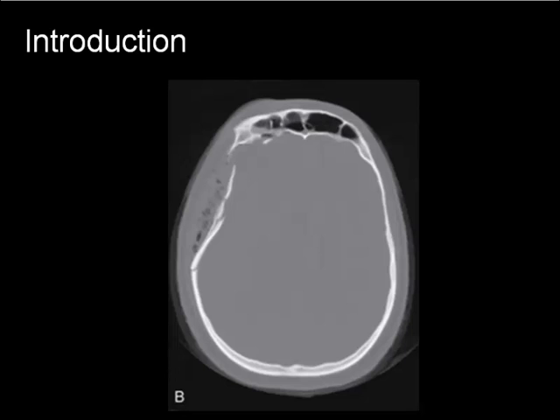Sectional imaging of the cranium may be utilized to evaluate the extent of blunt and penetrating trauma, examine for masses, or aid in the specific diagnosis of bone diseases, such as osteomyelitis or Paget's disease. In CT images, the window can be adjusted to demonstrate the bone or the brain, and both are of interest in many sectional imaging procedures of the head.